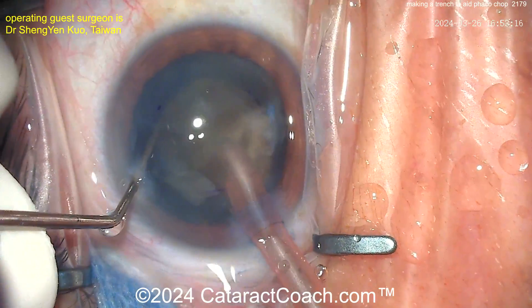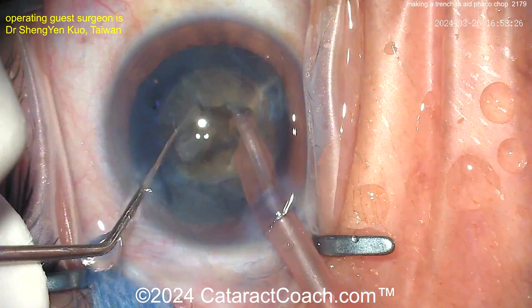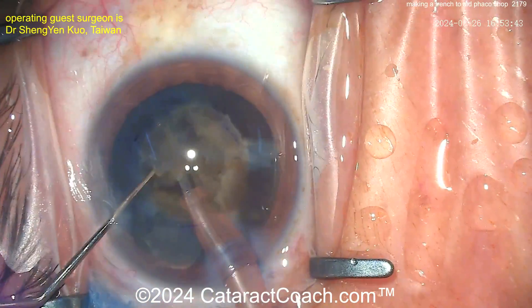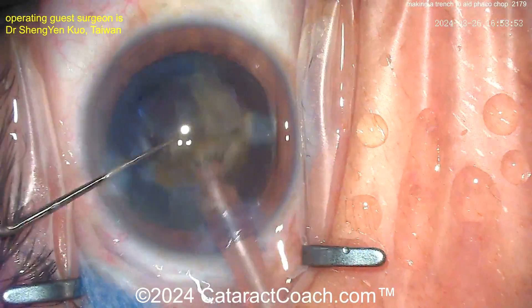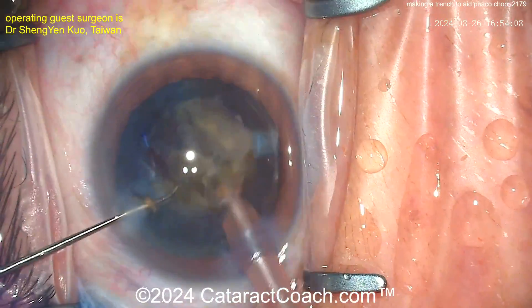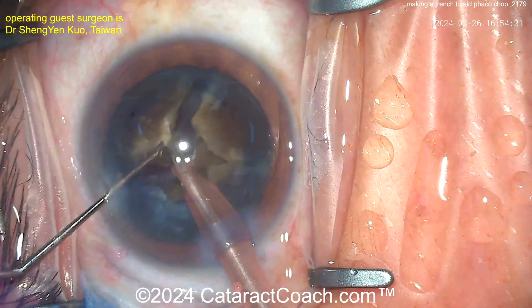The challenge here is that posterior plate. Coming in on that side of the trench — look at the amount of force you can put. If you're only using vacuum holding power, you really can't exert the same force — maybe 400 to 600 mmHg of vacuum holding power. But here you've physically trapped the nucleus between the two instruments, so you can exert a lot more mechanical force.